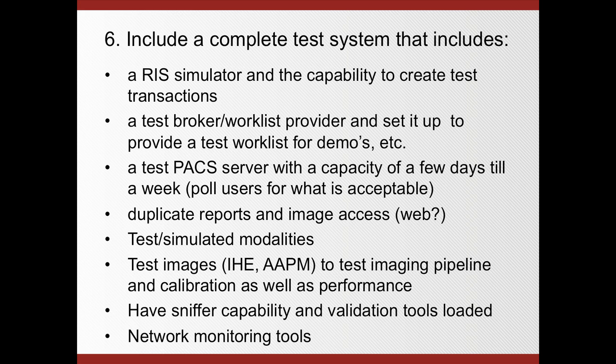You might want to poll the users to find out what is acceptable if the system goes down in case of, let's say, scheduled maintenance. In many cases, say that happens on a Saturday or Sunday over the weekend, the users will tell you that they're happy as long as they can see maybe the images from the last week and the reports from anything older, just for this particular occurrence of scheduled downtime. Now, of course, this doesn't happen a lot. It might happen maybe once every 2 years or so. But in those cases, you want to find out what is acceptable for the user to still operate.